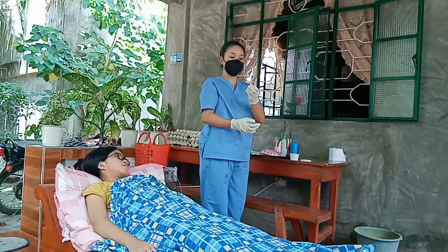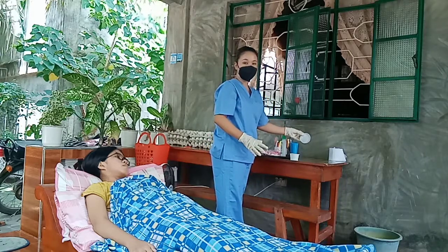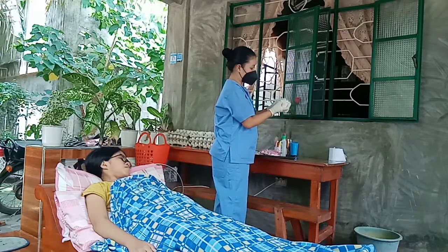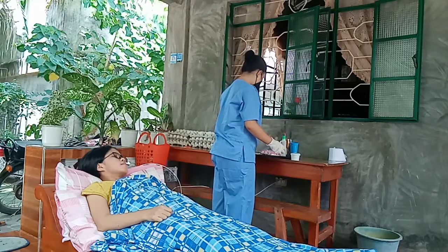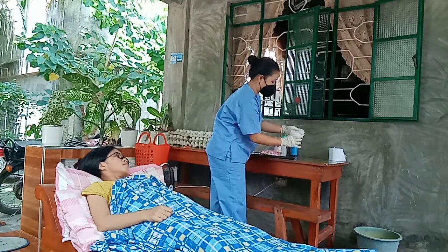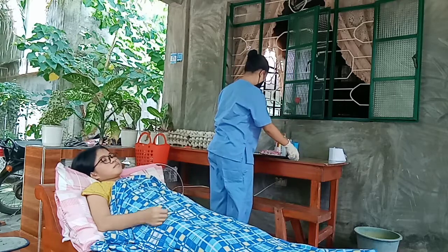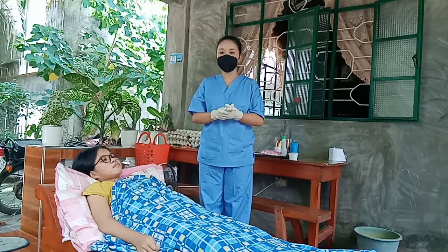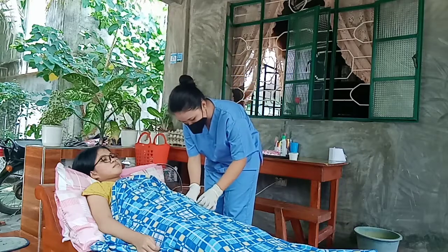Then next is dispose it to the proper receptacle. Then place the lid tightly on the container. So place the lid tightly. Then wipe the container. Dispose it to the proper receptacle. Then next is unclamp the catheter, ensure the urine is flowing freely. So unclamp.